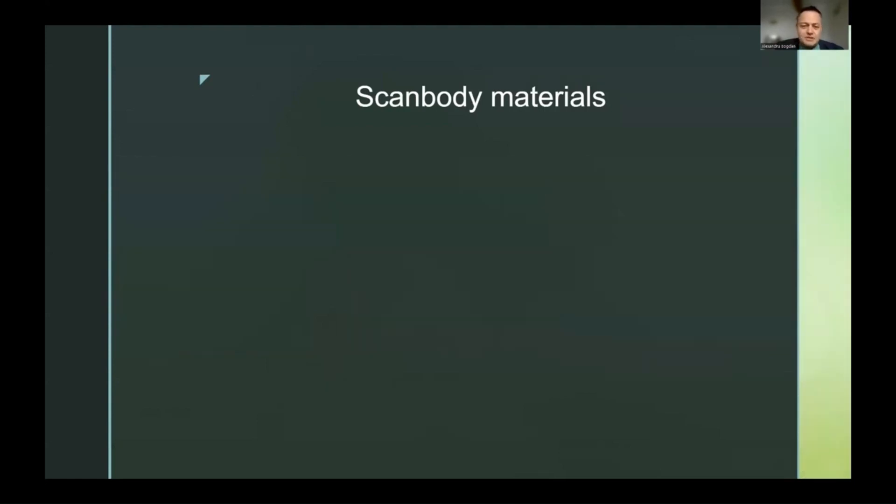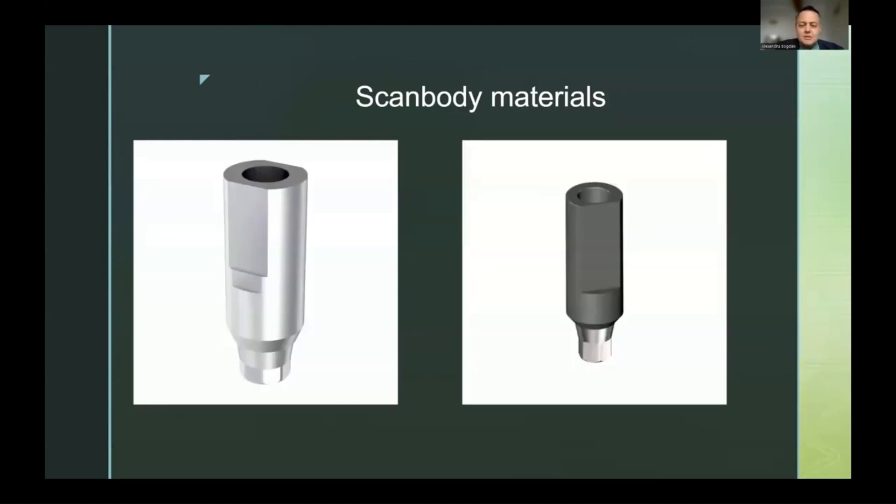This is why, in metal scanbodies, I prefer ones that are sandblasted. Sandblasting gives perfect scanning results on all components, the structure remains the same even after longer sterilization cycles, they are very easily scannable, and the results are very good. So one of my recommendations would be to try to find metal scanbodies that are sandblasted.